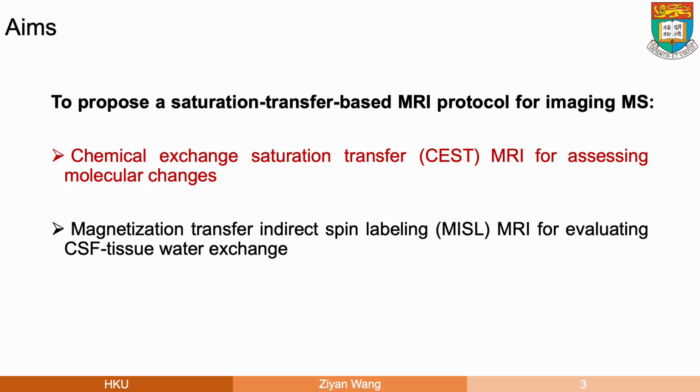In this study, we aim to propose a saturation transfer-based MRI protocol that includes CEST MRI for assessing molecular changes and MISL MRI for evaluating water exchange in the brains of patients with MS at clinical 3T. The first part is CEST MRI.